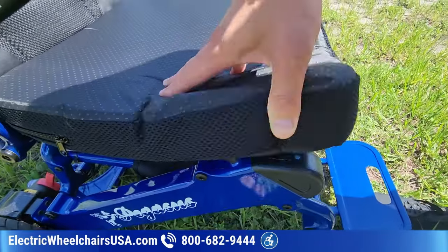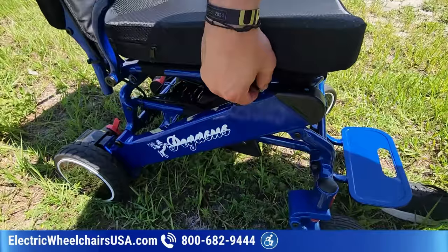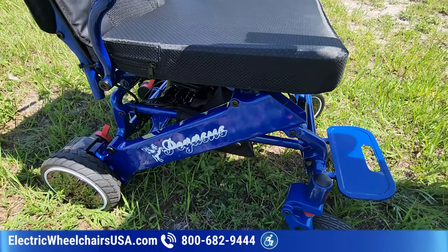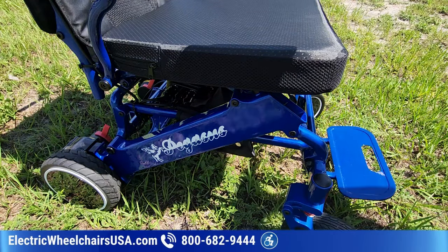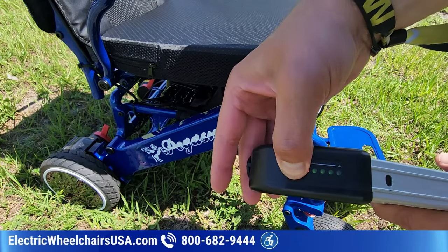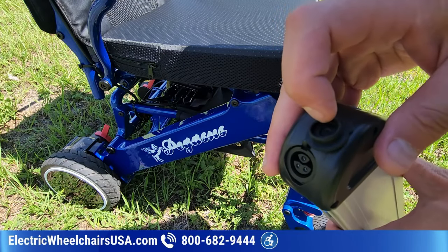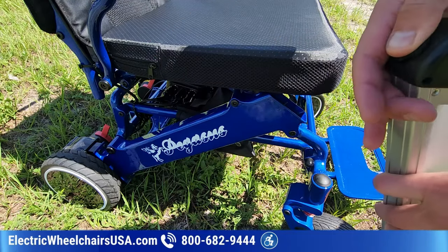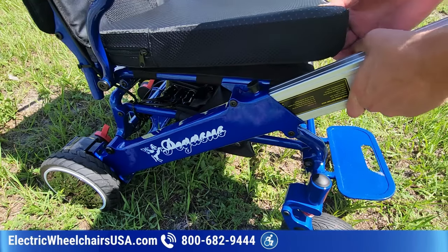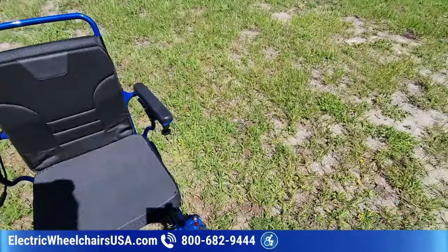So the batteries are really long and they go right in the frame here. If I pull this tab up, then it releases this and I can pull it right out. Now you can test the battery life by pressing this to see if it's charged. It's fully charged. You can charge the batteries off the unit, 1 battery at a time, so you don't have to bring the whole chair inside your home. And sliding them back in, super easy to do. That's how you charge the batteries off of the unit.